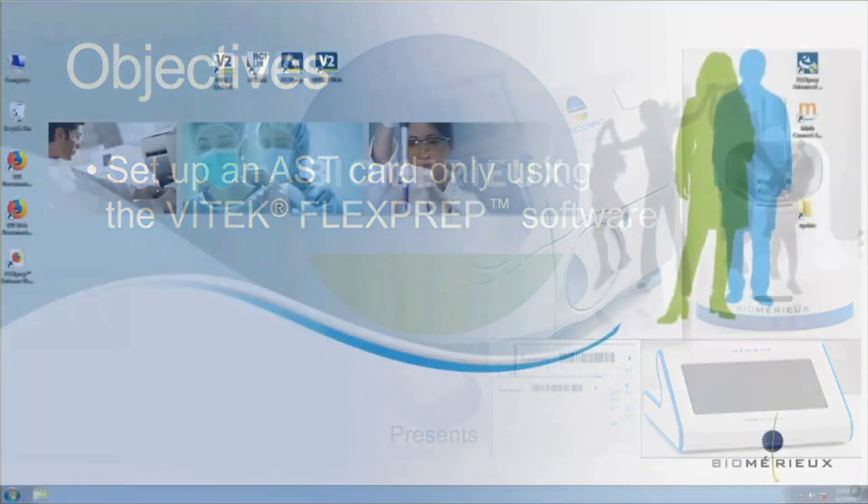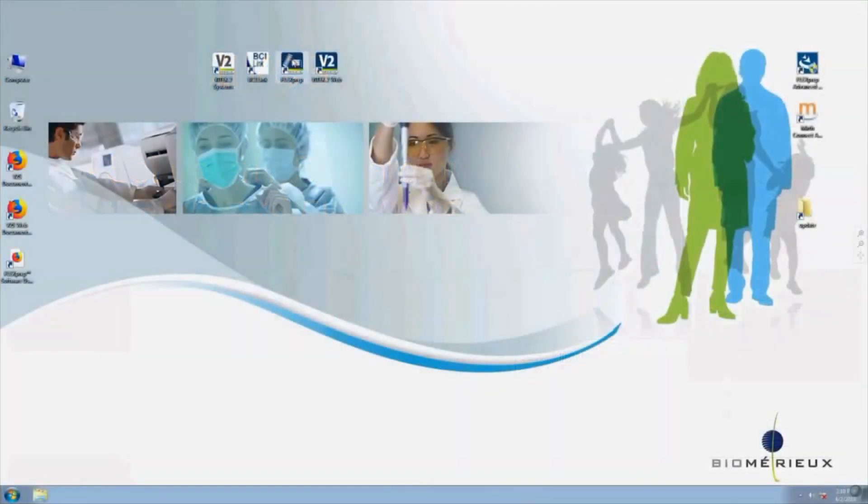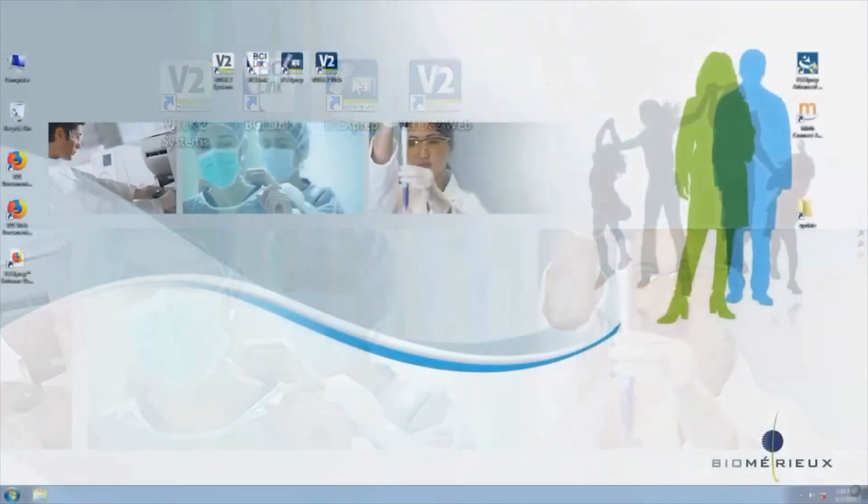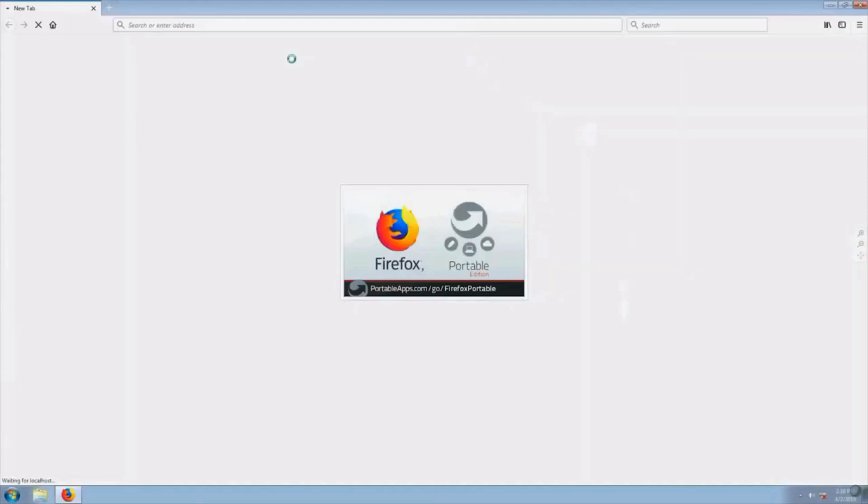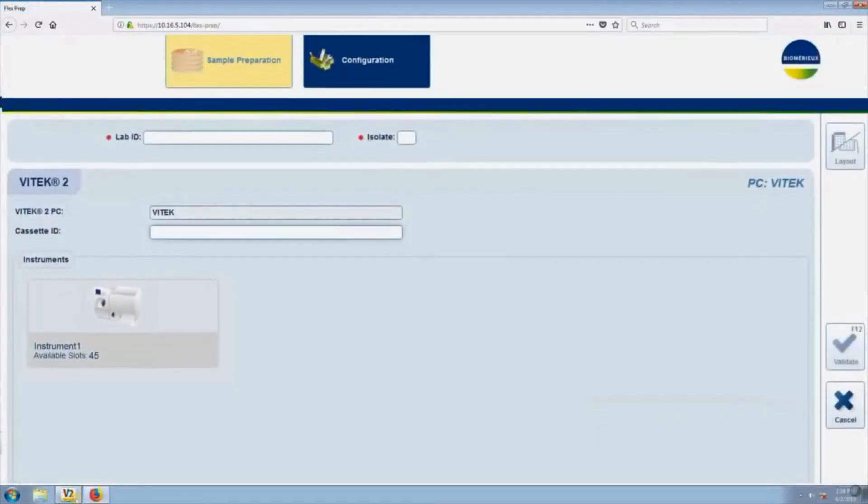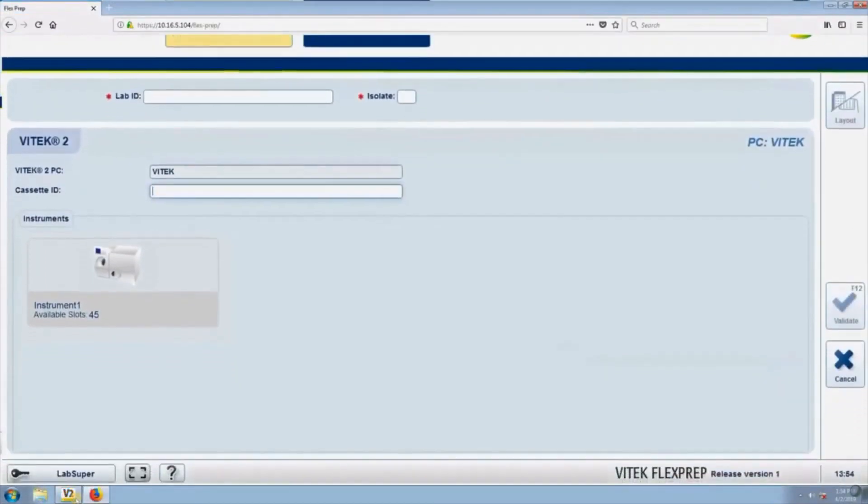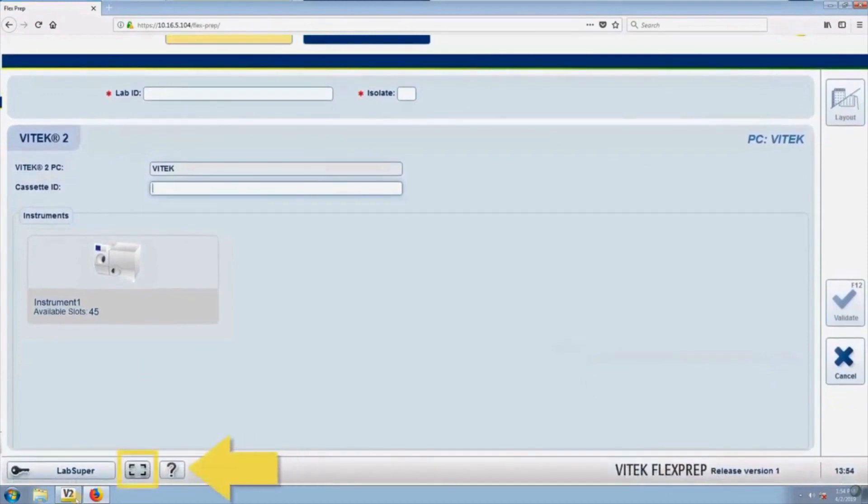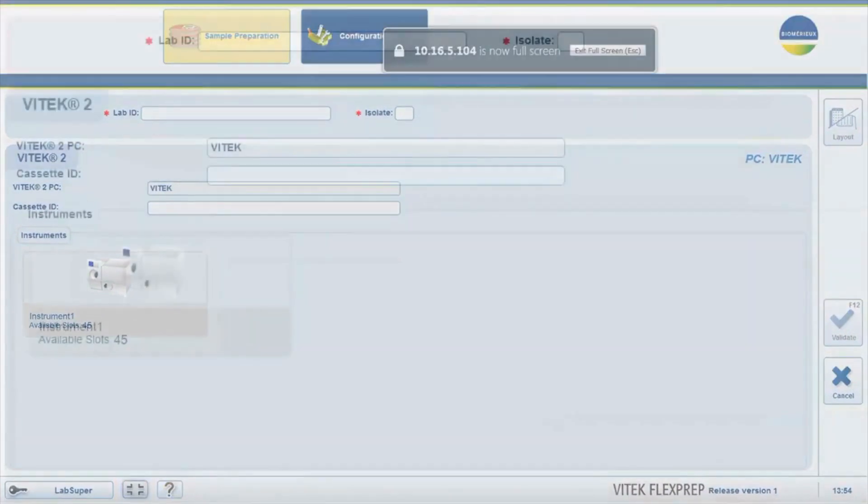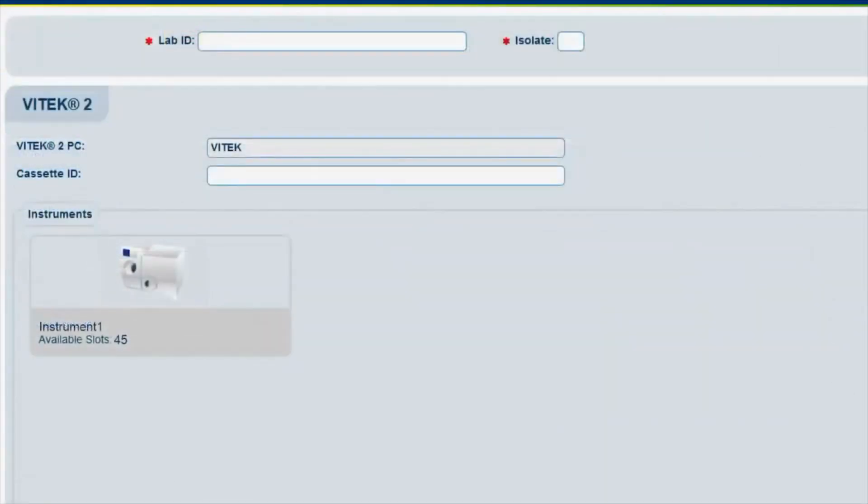To open Vitek FlexPrep, double-click the FlexPrep icon located on the computer desktop and log in. By default, the sample preparation screen will display. Click on the To Full Screen button every time that FlexPrep is launched. This is necessary for optimal screen display and workflow.